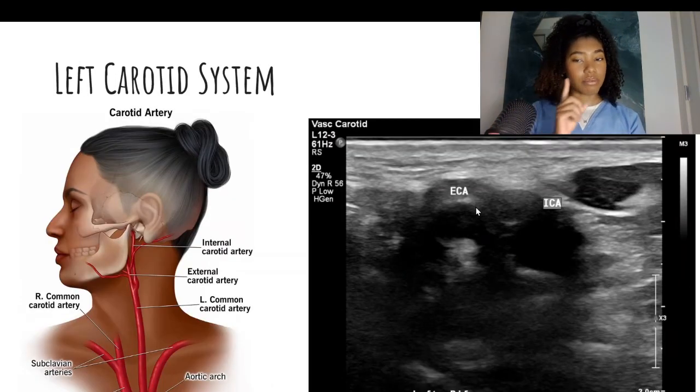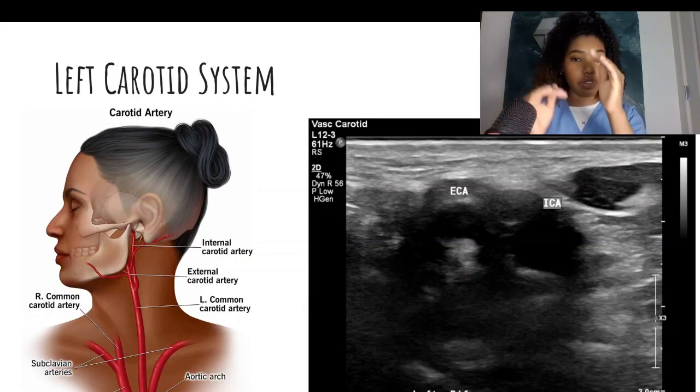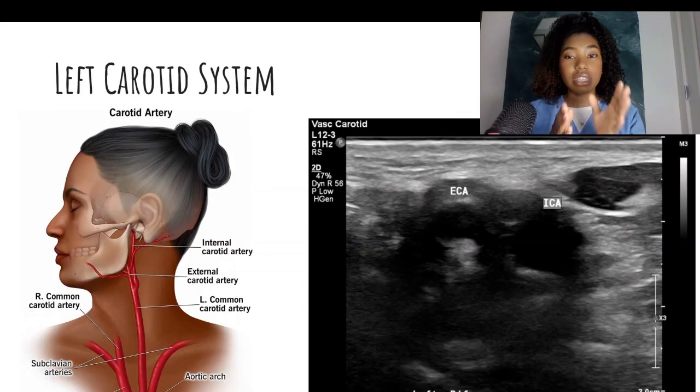For the left carotid system, the only thing that is different when you get to the bifurcation is that typically the ECA will be on the left side of your screen and the ICA will be on the right side. You will still have to check off those other boxes and see which one fits most of those criteria for each of the bifurcating vessels to confirm they are actually the vessels you think they are.